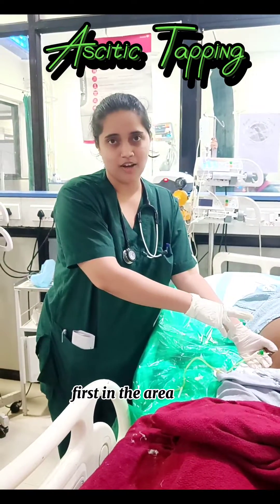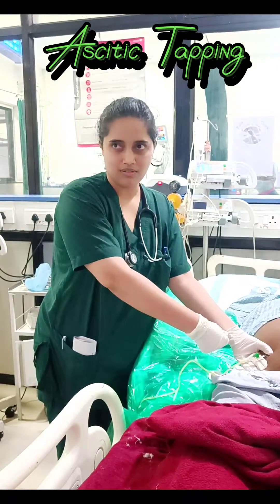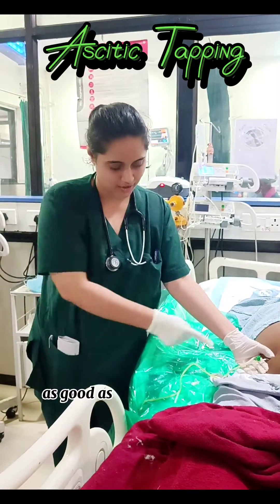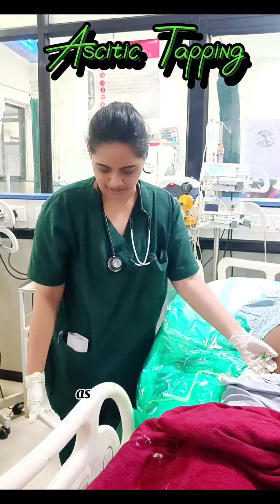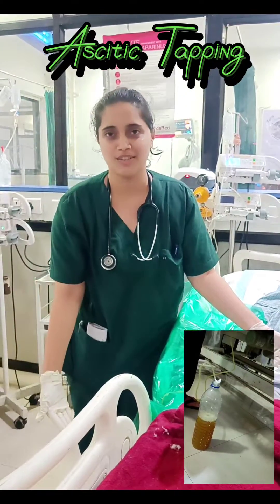First clean the area with Betadine spirit. Then put a cannula inside and retract the needle. You will see the flow of the ascitic fluid. As you can see, the yellow color is the ascitic fluid and we will drain the fluid. You can see down in this bottle — we are planning to drain one liter of fluid.